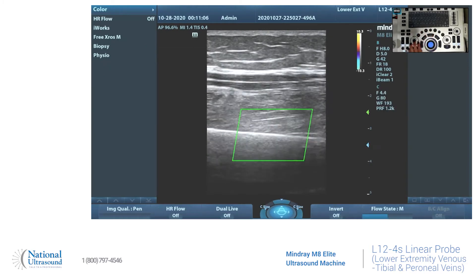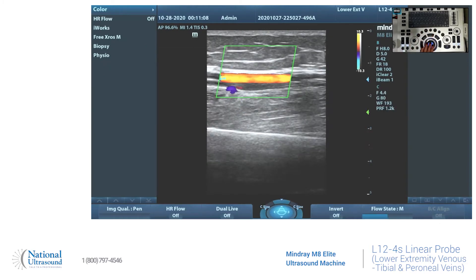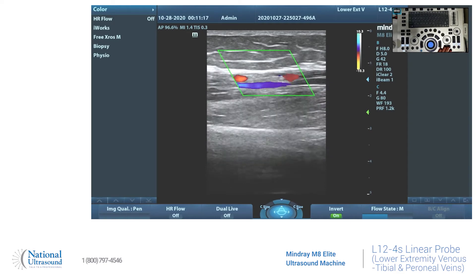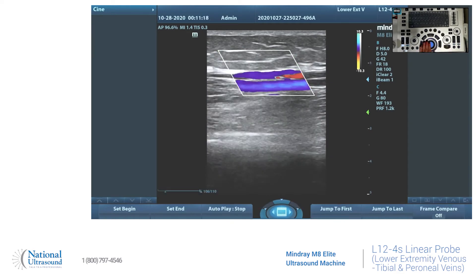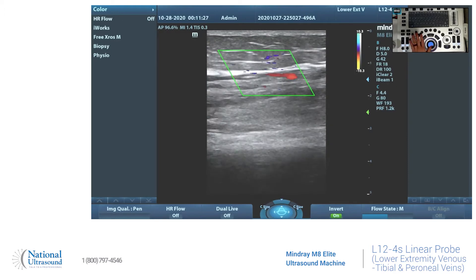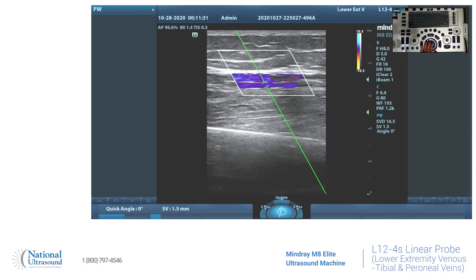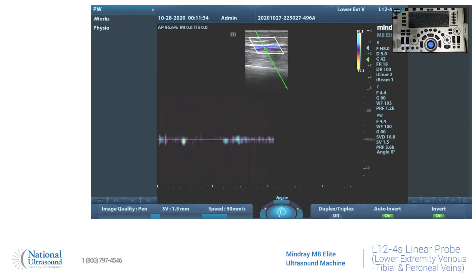They're really easy to compress sometimes. So the steering is not correct, so you're going to move the steering at the bottom of the screen by moving it all the way to the right. And then the color flow comes in beautifully. So then you can take that image — there will be your two veins and one artery. Then we're going to do a pulse wave of it. Hit update to do that. And then you show the augment.